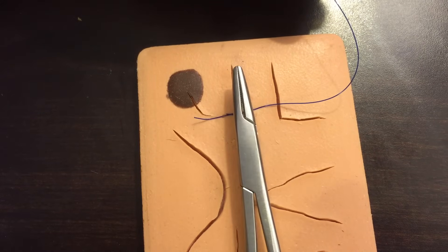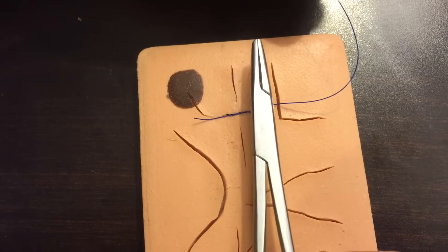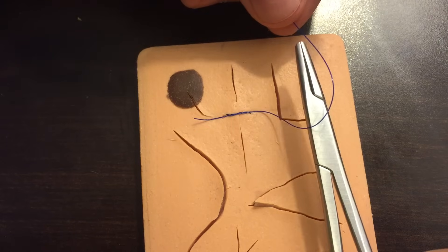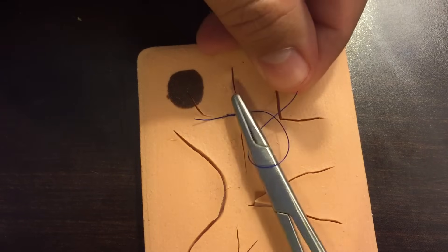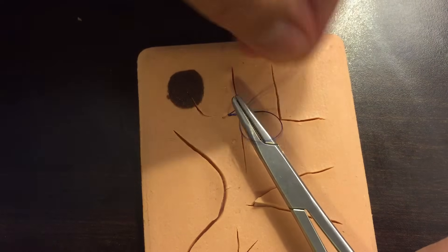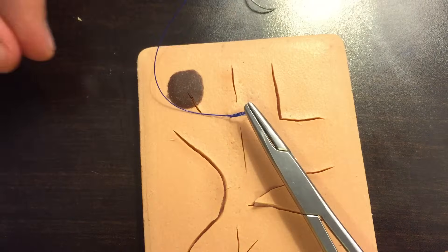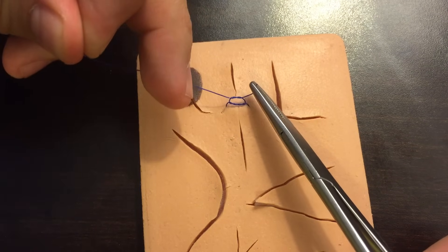To come back the other direction, be in the middle with your needle driver parallel to the laceration and come over the top. A common mistake is going underneath, which gives you a slip knot instead of a square knot. Start in the middle, come over the top, grab the tail, and with your pulling hand pull it in the opposite direction from the first time — that's what creates a square knot rather than a slip knot.